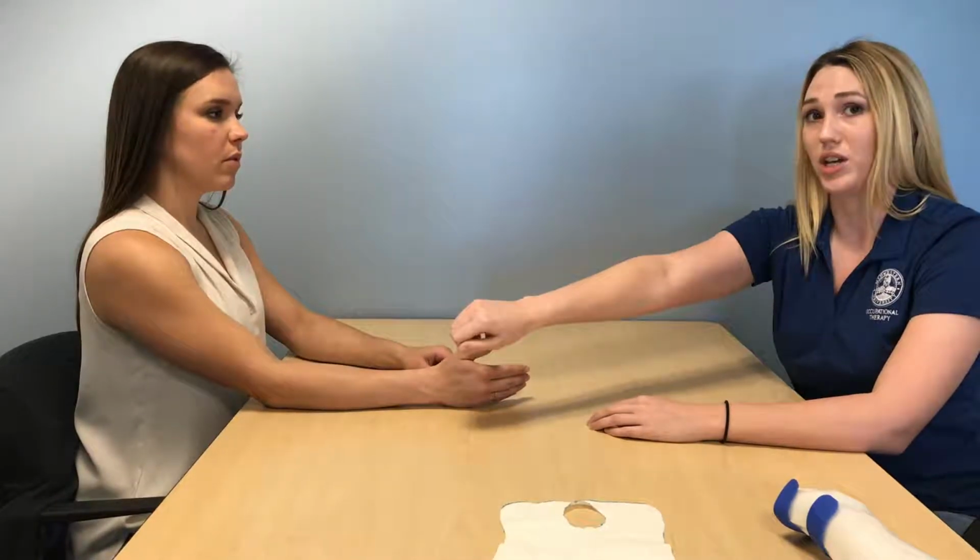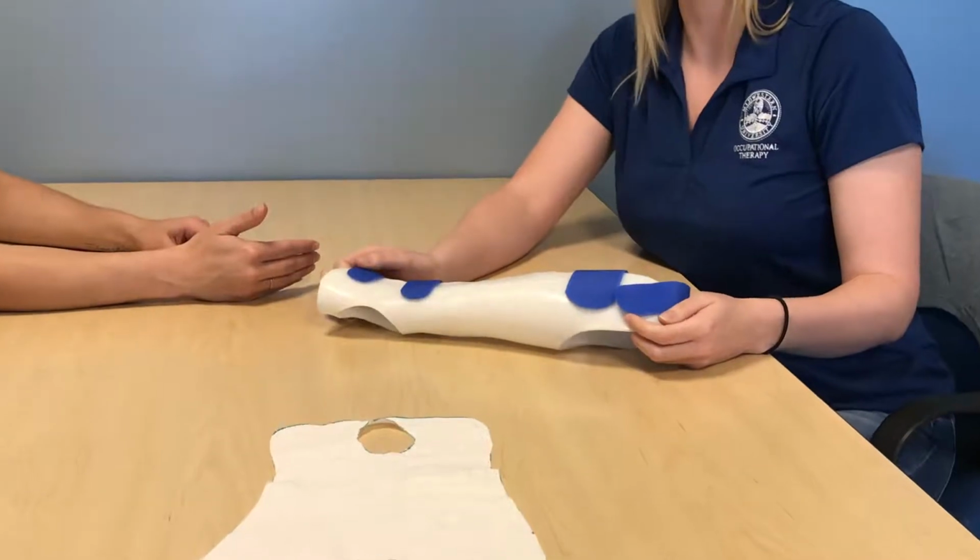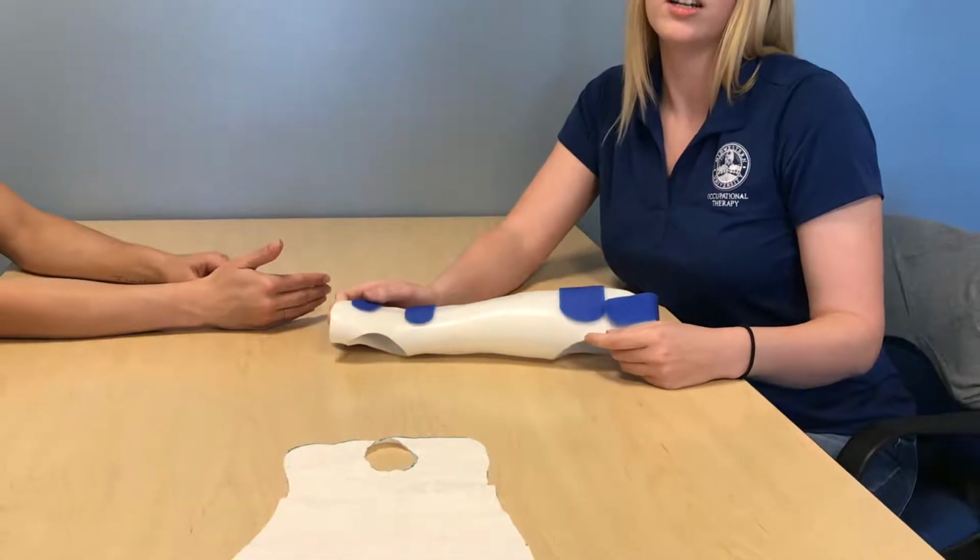So Kylie unfortunately has sustained a mid-radius fracture due to falling off of her horse. She underwent ORIF yesterday, and she's in need of an immobilization orthosis to prohibit any type of forearm rotation. So when constructing the orthosis, we decided to go with the Orfit Natural 1/8 inch.